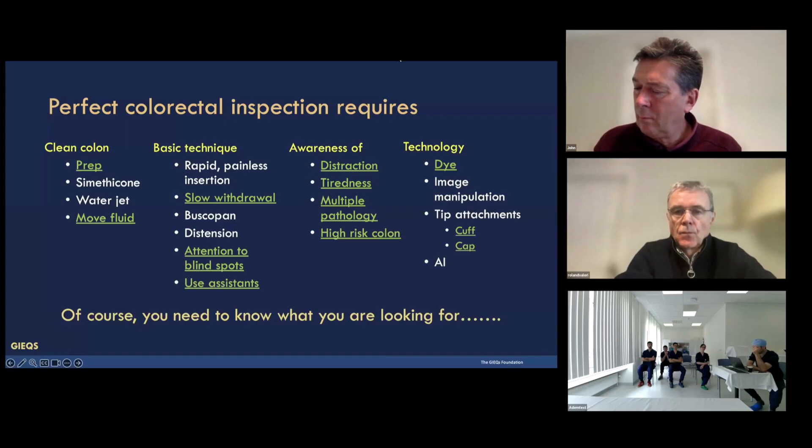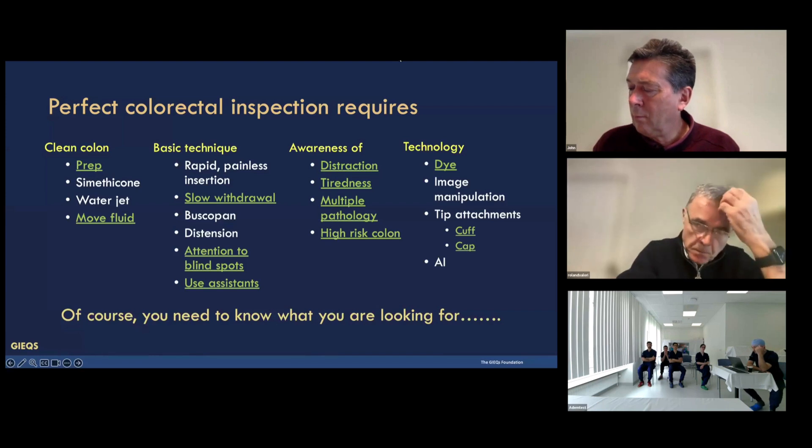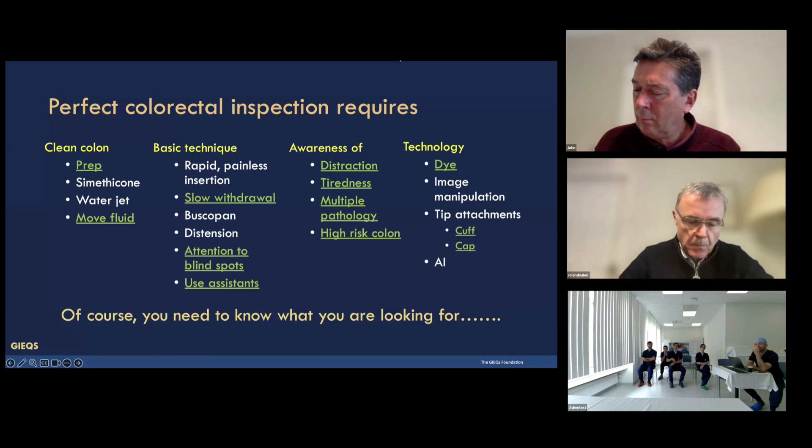We demonstrated the flexures — the flexion in the right colon and the rectum. We demonstrated how to examine the splenic flexure using a combination of anti-clockwise torque, the large wheel and the small wheel. And we use assistance, either artificial intelligence or nurses, to pick up polyps.